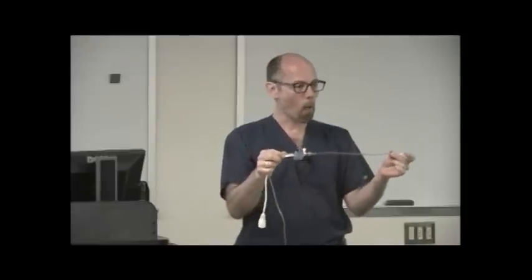What do you think the benefit is of having tubing like that between? Right. I don't want the pressure that's coming from the patient to be absorbed by the tubing. I want the integrity of that pressure waveform to be the same as it is at the tip of the catheter that I'm measuring that pressure from, all right? So that's why. And the length of the distance between the transducer and where I'm connecting it to the catheter also matters. You never want to have more than about 4 feet of, and this is called pressure tubing.